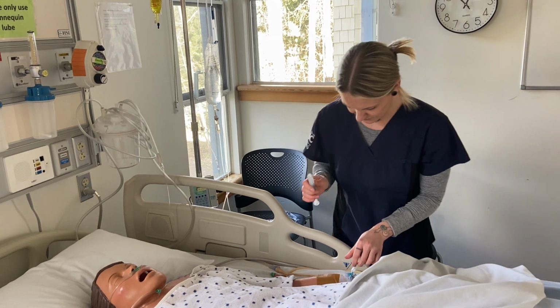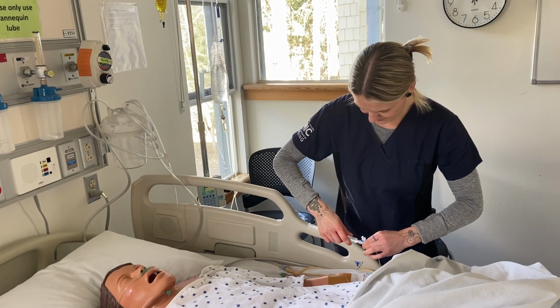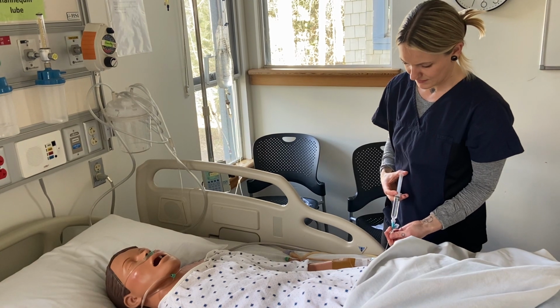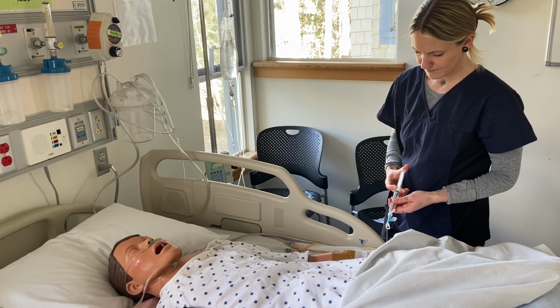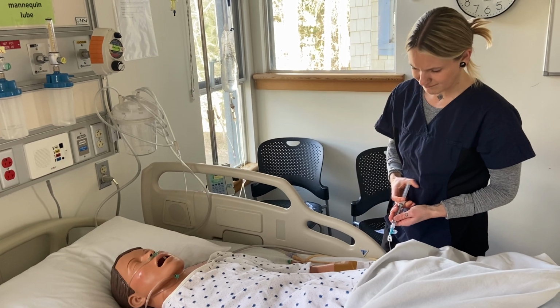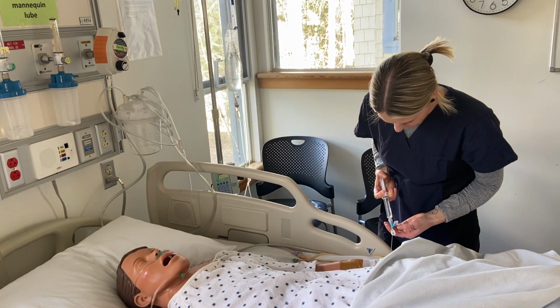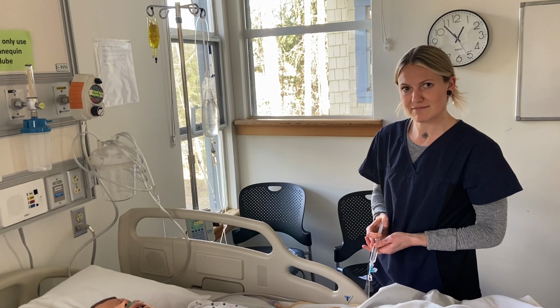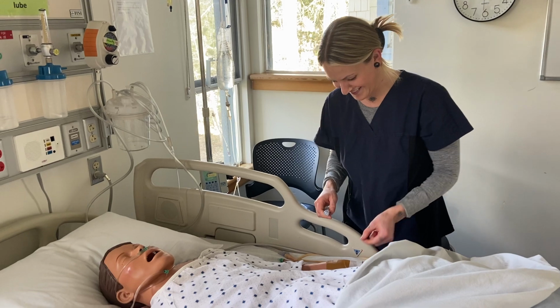Okay, Jen, I'm just gonna flush your IV with some normal saline. Okay. You're gonna feel a little bit of maybe cold fluid going through there, so just let me know if there's any discomfort. It's unclamped. Okay. And we did an IV flush.